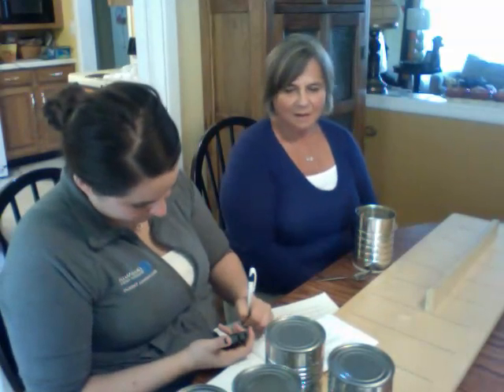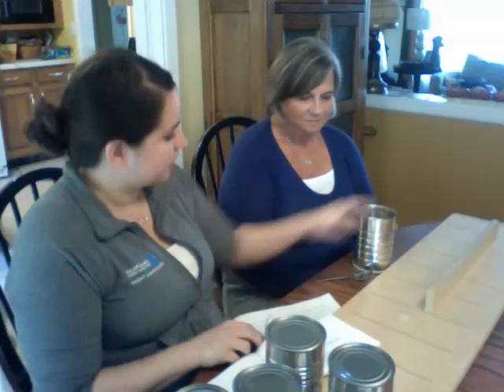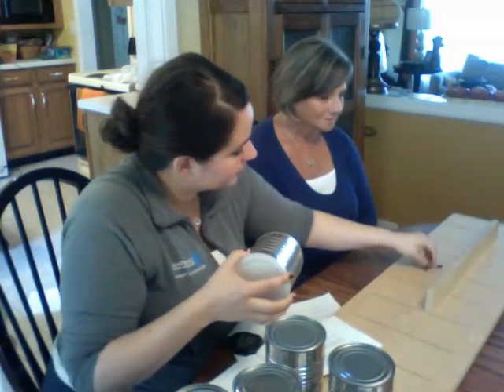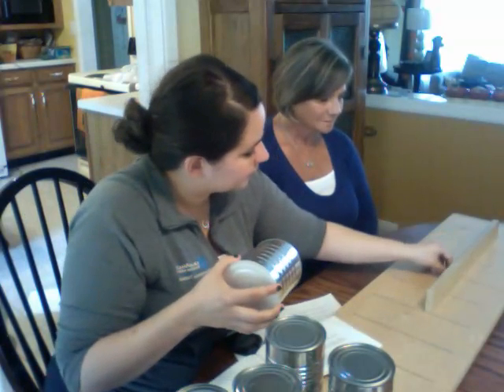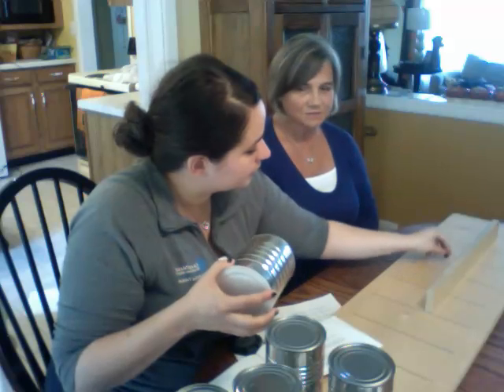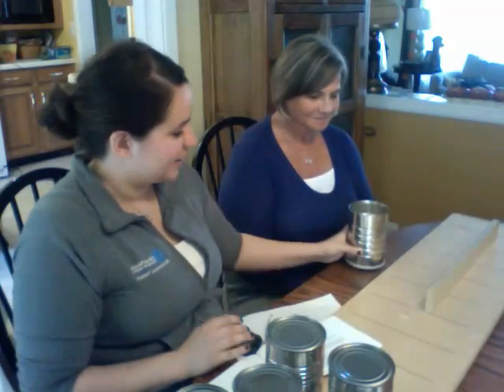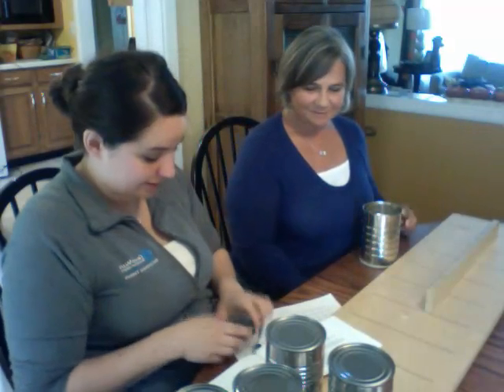Very good. All right, we'll go ahead and do this one with your dominant hand. Has any of this felt difficult for you so far? Or are you doing just the writing with your non-dominant hand, right? I know you had a lot of anxiety about that one, but you did a really good job.